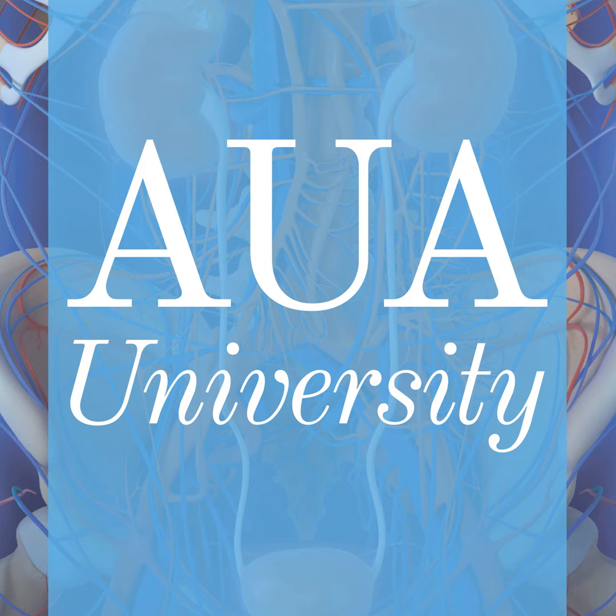We have a couple of patients who demonstrated some intraductal prostate cancer elements in the radical prostatectomy specimen, or had some cribriform elements or small neuroendocrine elements, which were then responsible for the PSA rise, but which are not detectable by a PSMA PET scan because all these elements are PSMA negative. In this situation, I get an FDG PET CT scan, which is usually positive.